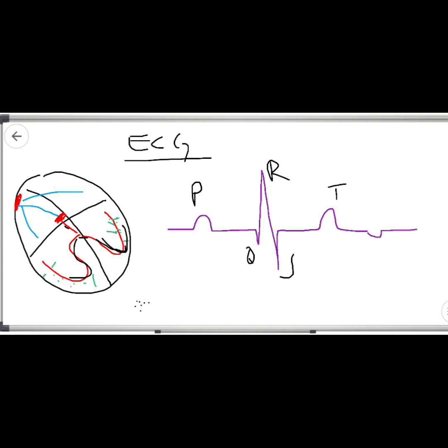So where is the atrial repolarization? Atrial repolarization is masked by the QRS because that's big enough. When the ventricles are contracting in the QRS, at the same time the atria are relaxing. So that is masked by the QRS complex. Now, sometimes after the T wave, there is a small U wave as well. We're going to discuss each and everything separately in different videos.